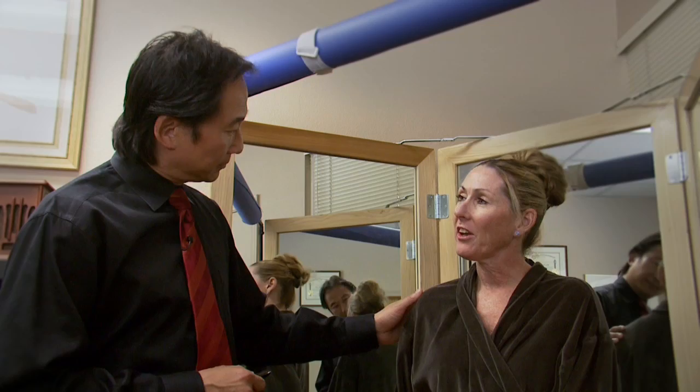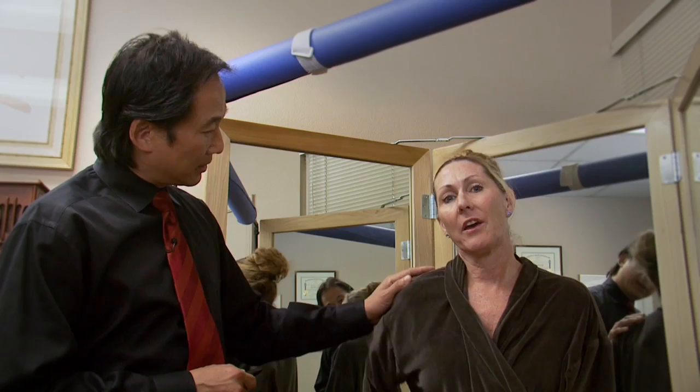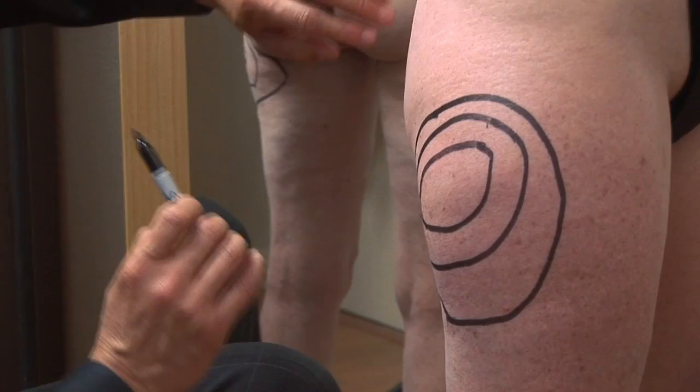We're going to take care of the outer thighs — what we call the saddlebags — and the inner thigh, and then up on the upper hip. So we're looking at Candice's outer thigh area and what we call the saddlebag. That's the area that we're going to look at.